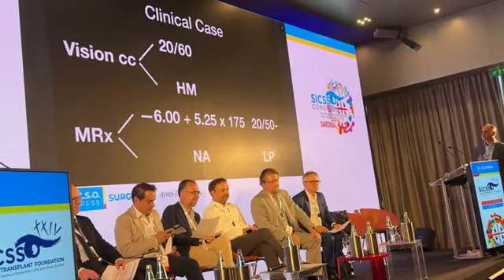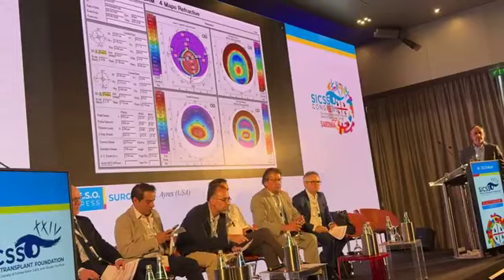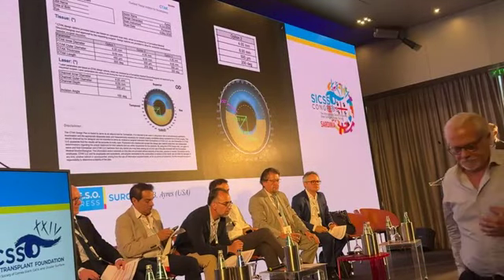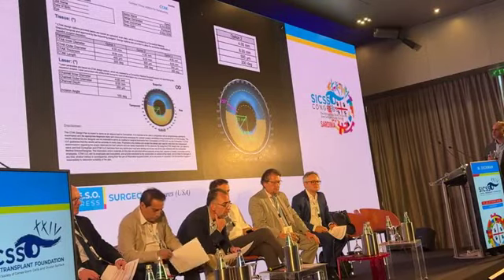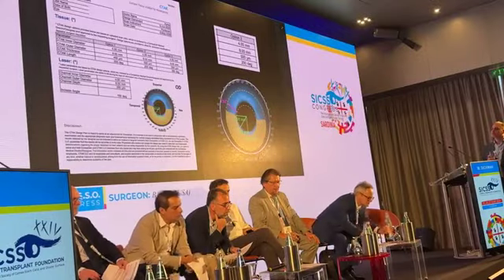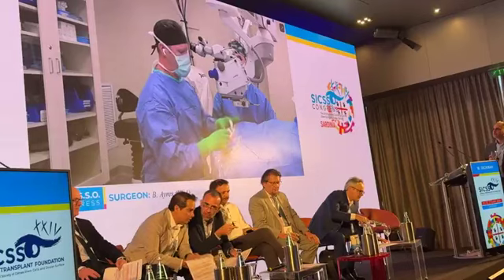I can show you a copy of his topography. This is his Pentacam. On the next page, we can show the CTAC plan, which has been run through the nomogram. Things I would call out: this is a thicker segment. We're going to be doing a 500 micron segment, and the incision axis is at 150. We'll show that at the microscope. Let me get the lid speculum in, get our microscope light on, and switch over to the surgical view, and we'll get things done.